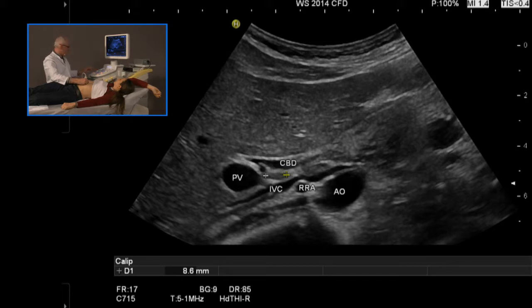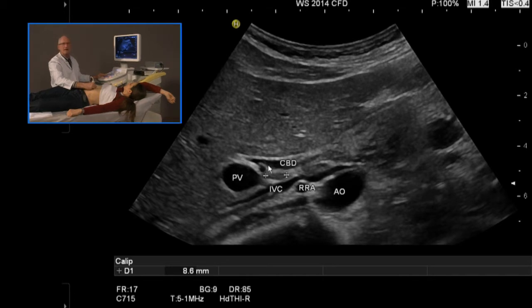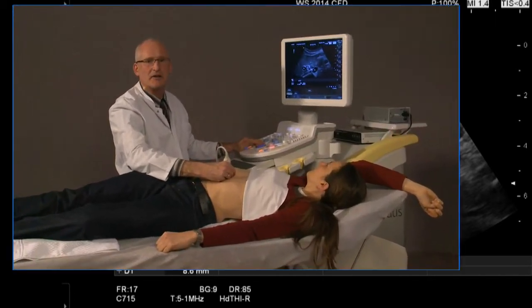Please note that this lymph node is termed the cystic duct lymph node — look for the arrow. You can nicely see the cystic duct coming into the common bile duct structure.